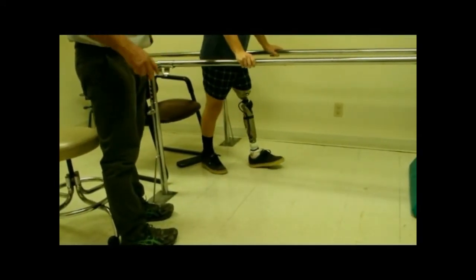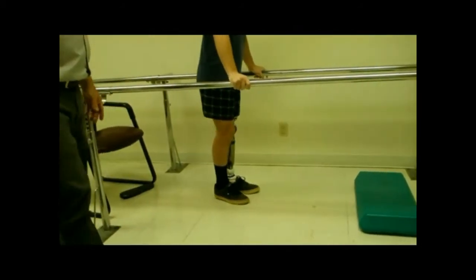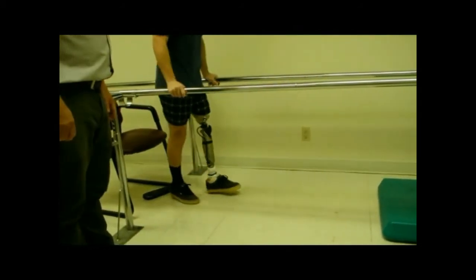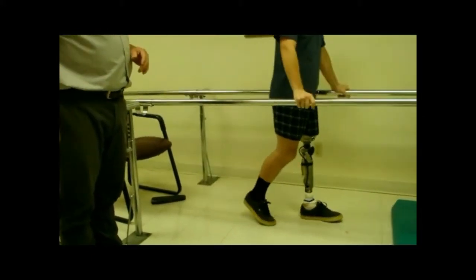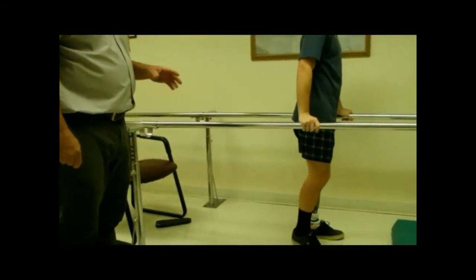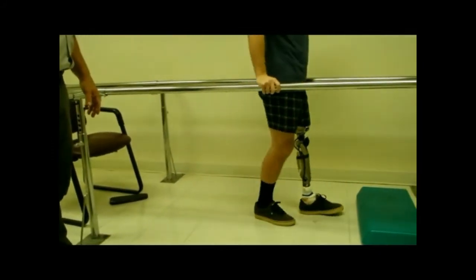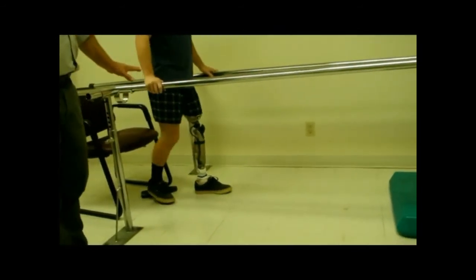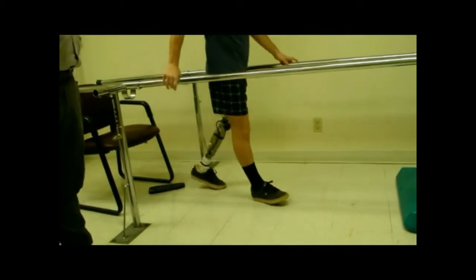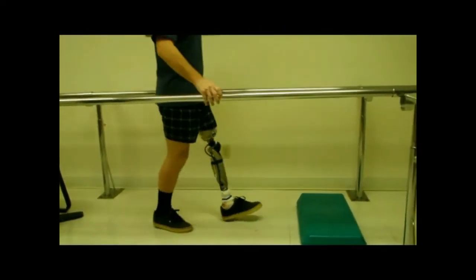There we go. You feel the way it has resistance. It has control. There we go. Good. That's a little slow. It's a little bit too much strength there. It's a little hard for him to bend it, but it gives him time to take a step backwards. So I work this technique with clients, and they get to understand yield. They understand they have time. They can do this. They can ride it.